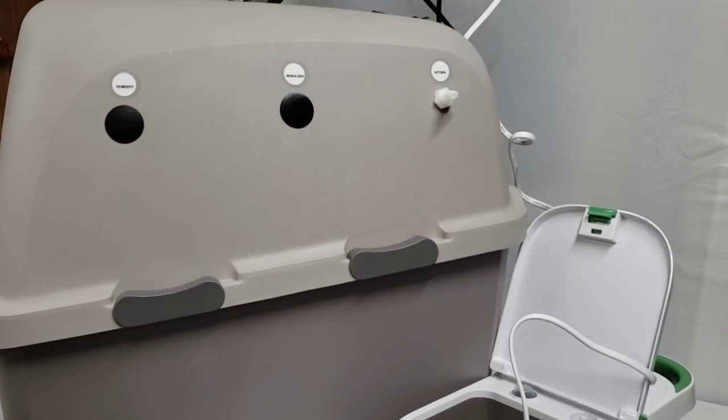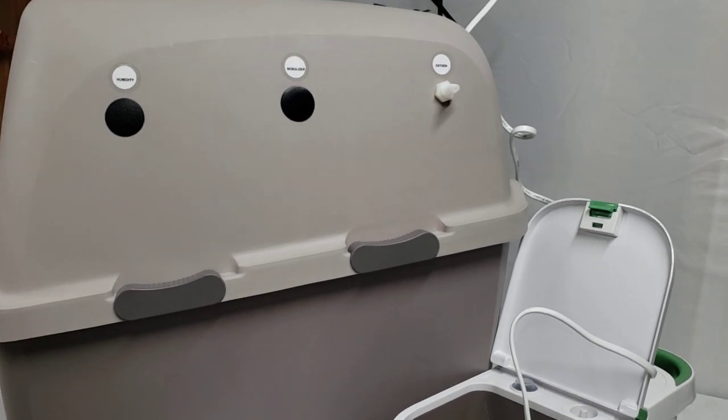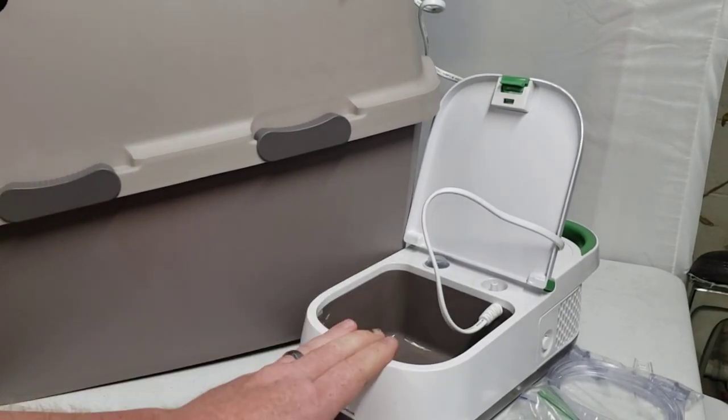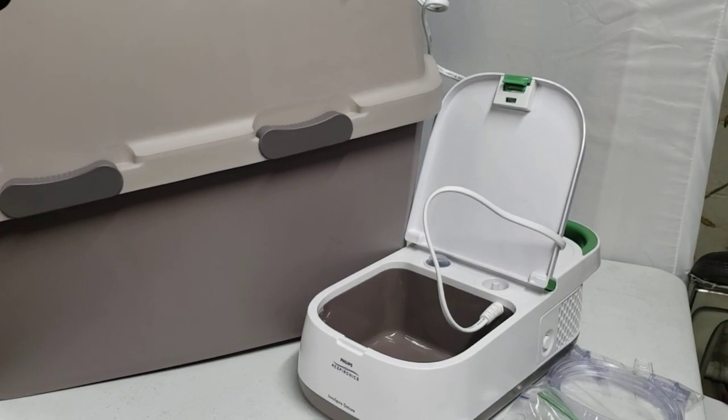Hi, this is Jake with Lifeline Pet Supplies. Today I'm going to cover the Lifeline Pet Supplies Puppy Kitten Pet Incubator ICU. We are going to go over a nebulizer connection for the unit. So if you have a nebulizer yourself or you have purchased one from us, I have the Philips Respironics InnoSpire here. I'm going to give you a breakdown of how to hook this unit up.